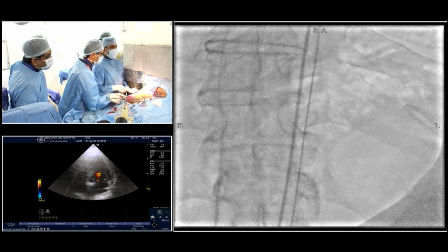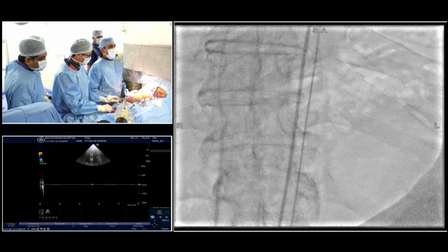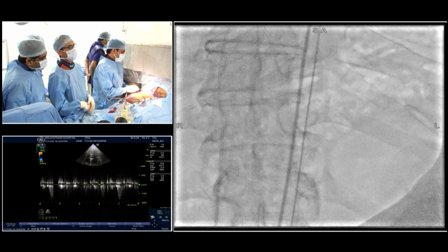Okay, so I think we are done from our side. We already showed the hemodynamics. There's no aortic gradient, basic, no aortic regurgitation. Dr. Ravin, what was the rhythm? Is it very difficult to identify a bicuspid aortic valve even on transesophageal echo?